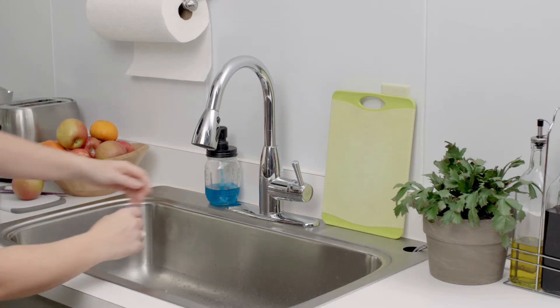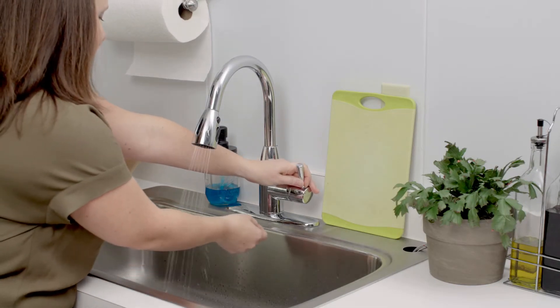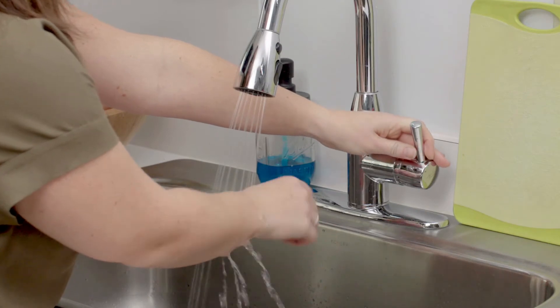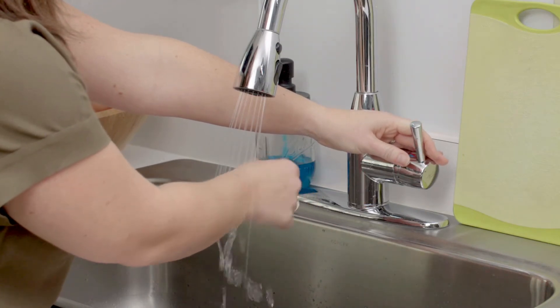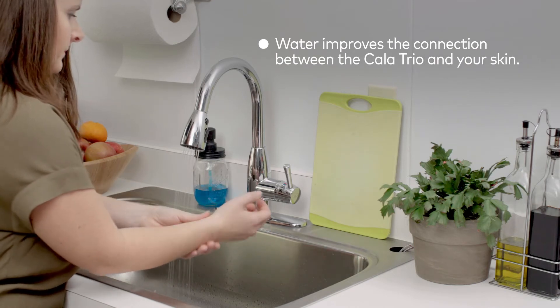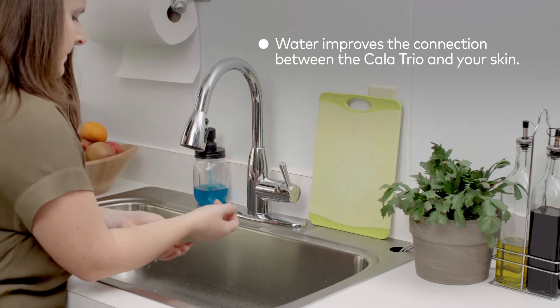Okay, let's get started. Before putting on the Calatrio, you'll need to apply water to your wrist. The most effective way to do this is by running your entire wrist under a faucet, like this. The application of water is essential in creating a connection between the Calatrio and your skin.